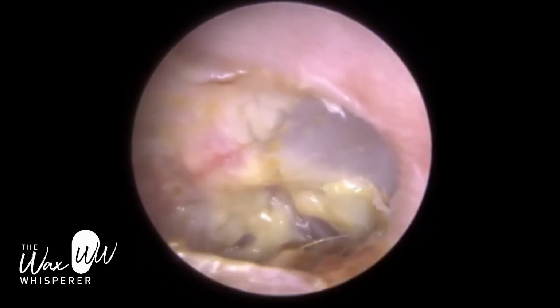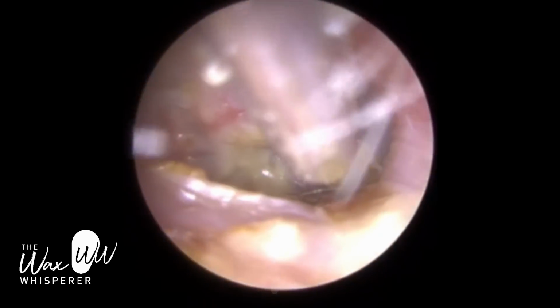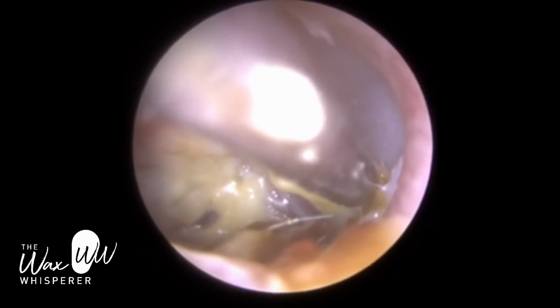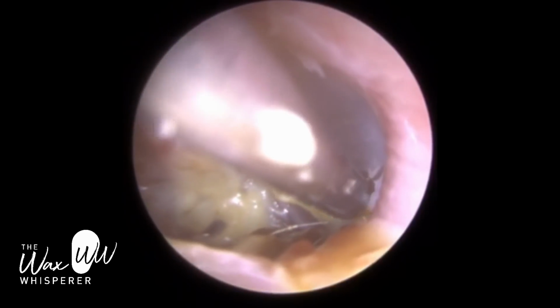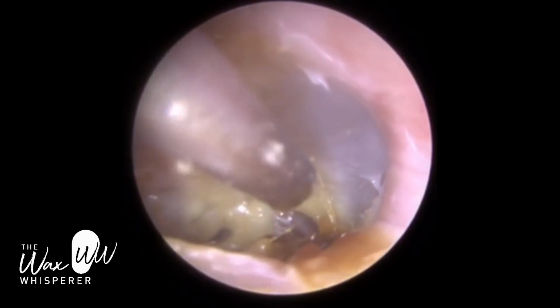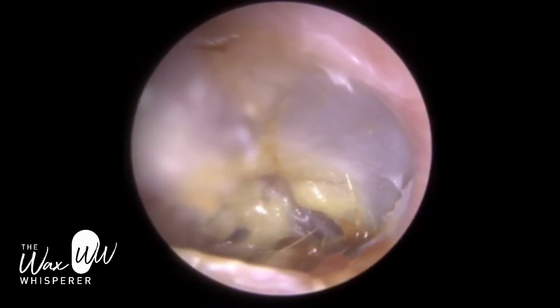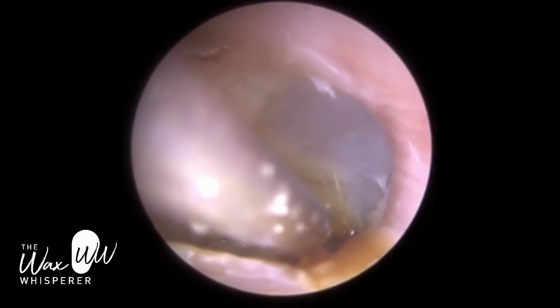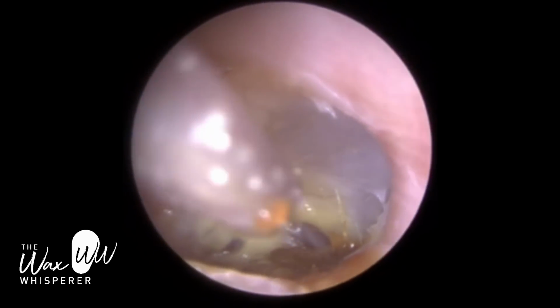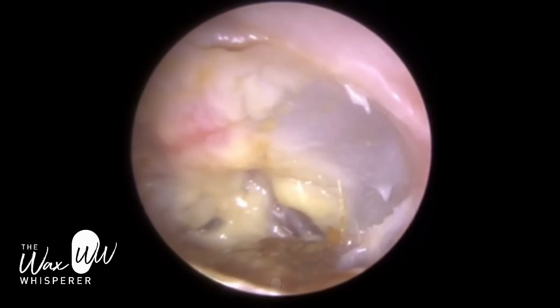So we've cleared most of the blockage. We're just working on the eardrum now. The eardrum is visible, the patient's symptoms have dramatically improved, but you can see the patient's got a lot of embedded and dead keratin on the eardrum. And some of the wax is stained as well. The staining of the earwax is more apparent in the second ear, so do stay tuned for that. The patient could barely hear anything when they came in, they couldn't even hear the suction machine, and at this stage they could, so it's made a dramatic improvement.